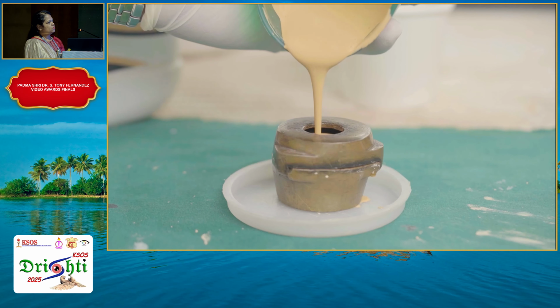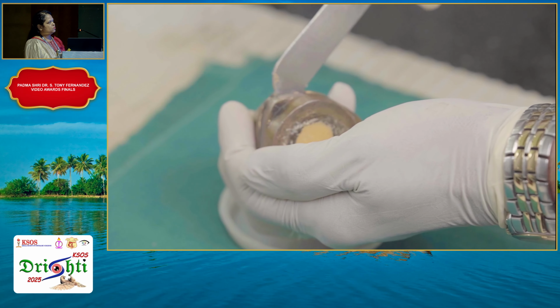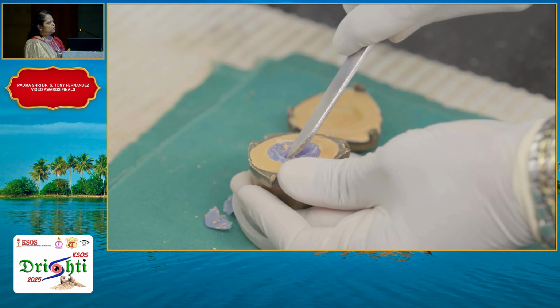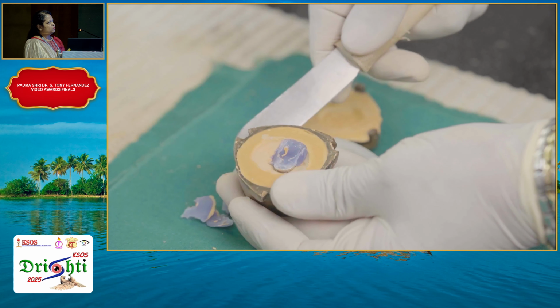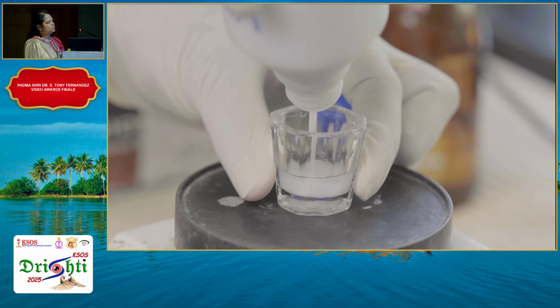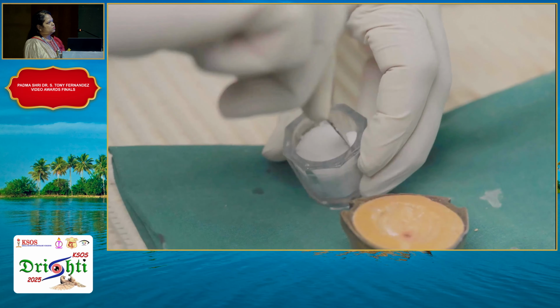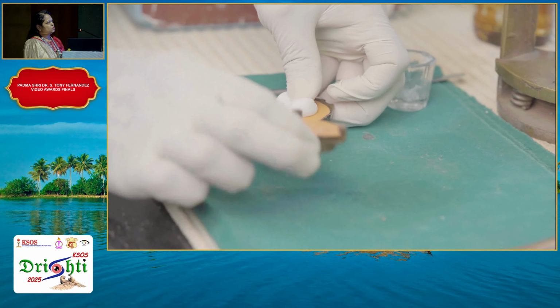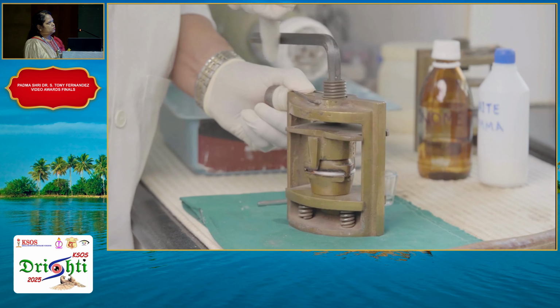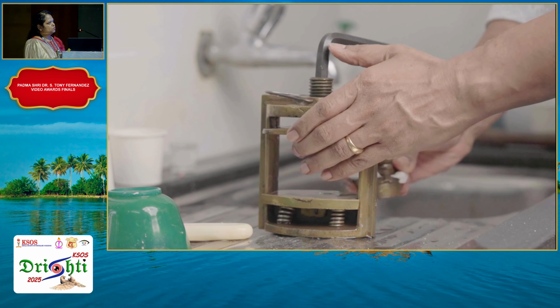Again, the plaster is mixed and filled into the other half of the flask. It takes about half an hour to set, and once it is set, the corneal button along with the wax is scraped out. Now the plaster is ready for acrylic casting. In a short glass, white PMMA powder is mixed with monomer liquid to form a dough. The white PMMA mixture is placed in the plaster mold and the two halves are put together and placed in the bench press so that extra plastic leaks out. This is placed in the water bath for 45 minutes at 100 degrees centigrade.